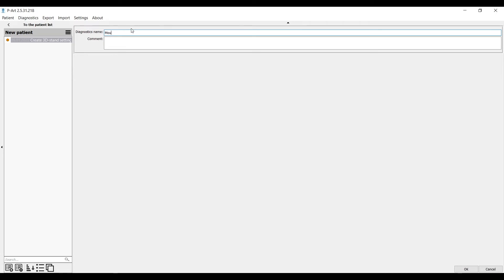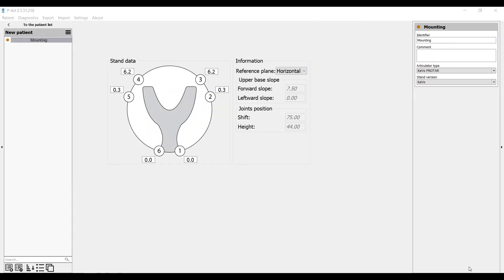We advise to name each diagnostic. It will help you to orientate in the menu and save your time. And after you press OK, you will get information for the rack.